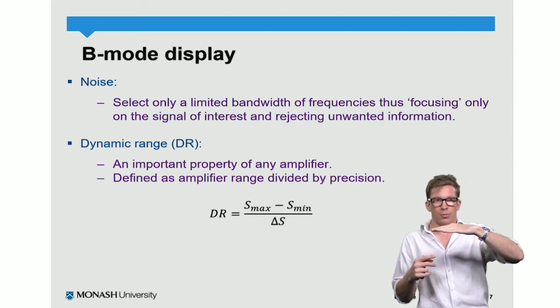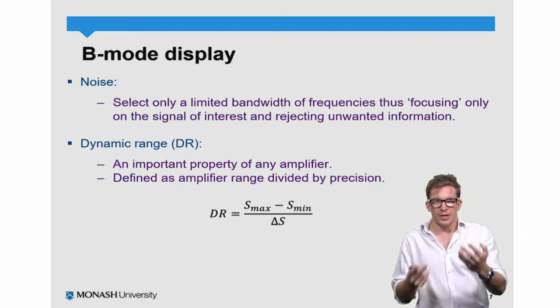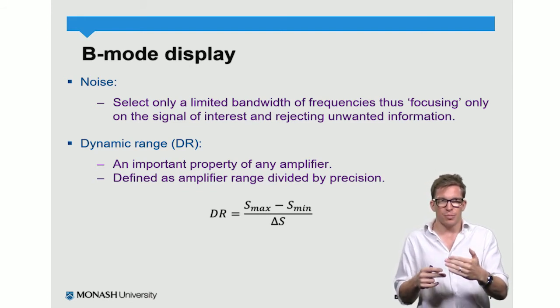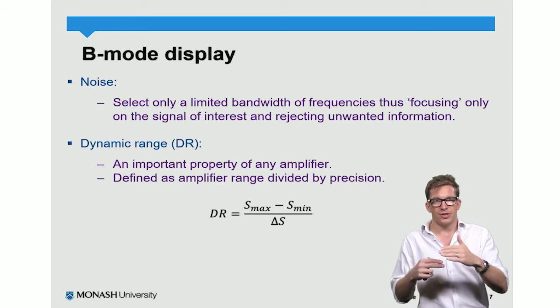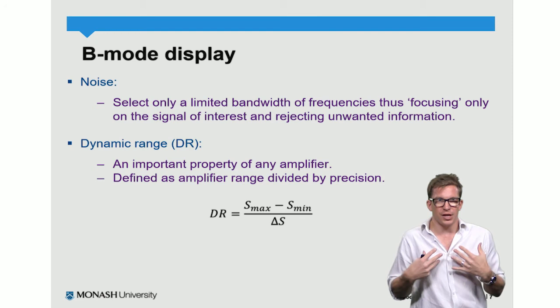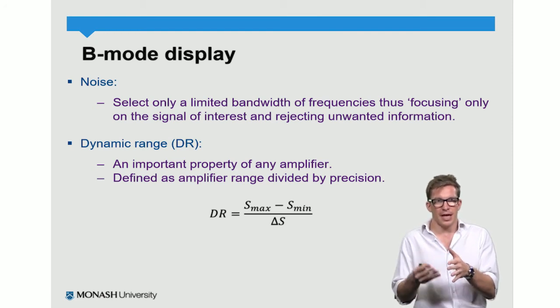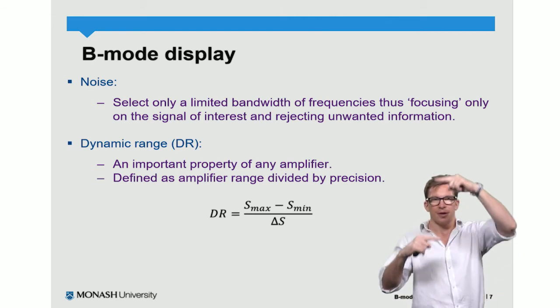So we probably wouldn't want to go in 5-degree steps, because the resolution of that thermometer would be very inaccurate. But at the same point, we wouldn't want to go in steps of 0.00001 degree, because those steps are unresolvable to us as humans. So the dynamic range calculation takes into account both of those effects. It takes into account the length of the range.